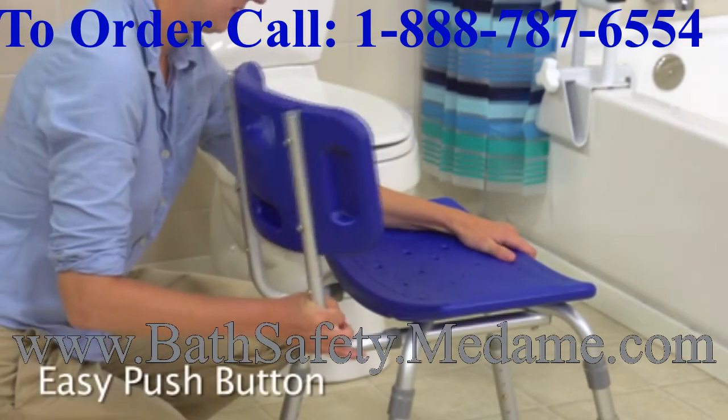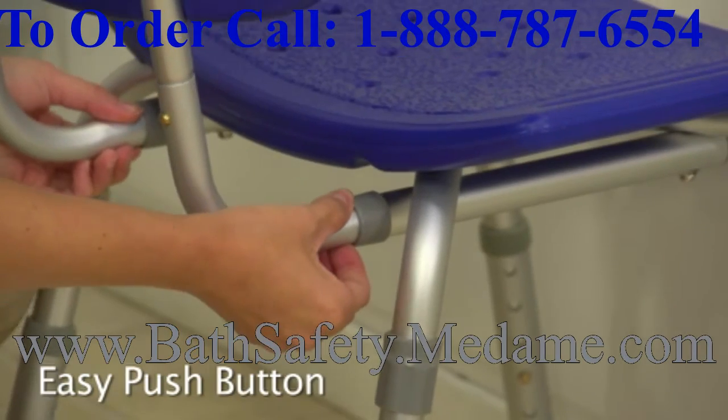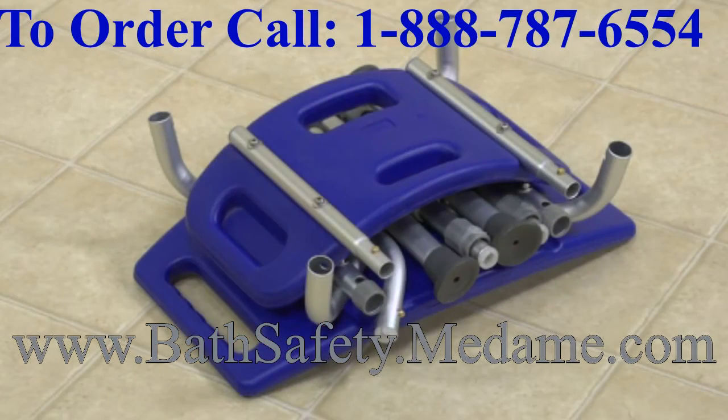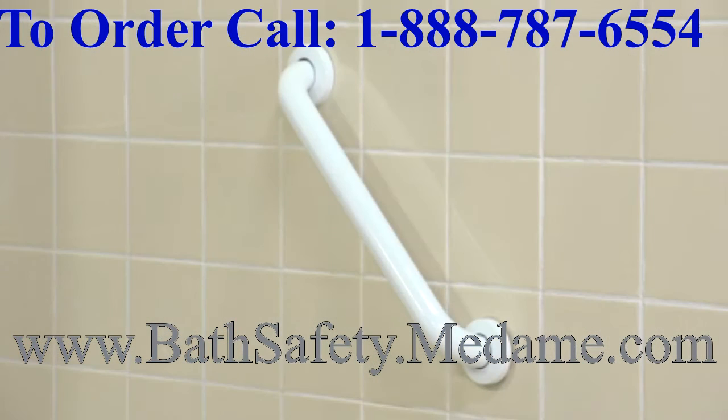The back, seat and legs all snap together easily, so no tools are required for quick assembly. And it's easy to disassemble for travel. When using a shower chair, consider adding a shower sprayer, bath mat and grab bar for additional safety in the bathroom.